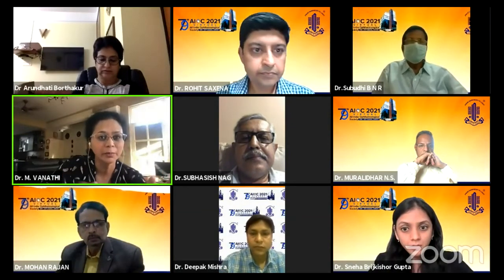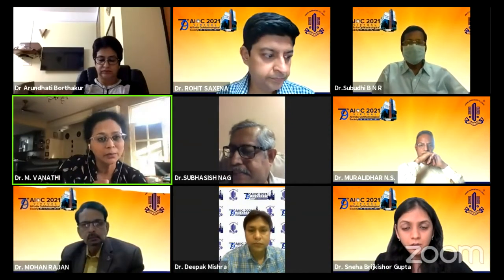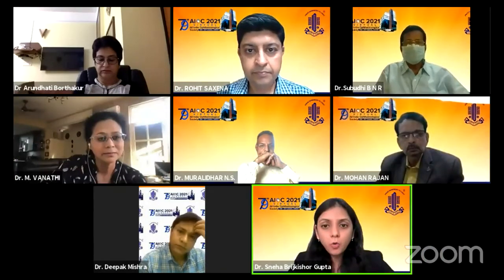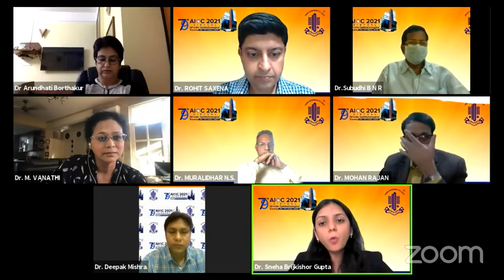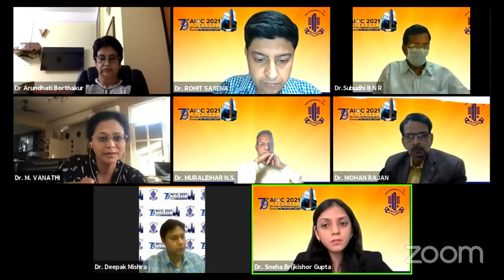One question to you, Sneha. How did you compute this? Of course, I guess it is a software which is inbuilt, but what was the population with which you compared to evolve this simulation? Ma'am, we had incorporated 529 eyes initially, and now we are still including whatever patients we are adding every day. So you have used normative data of refractive surgery patients of Indian eyes, and you have compared their biomechanical changes which have happened, and you apply this to your test population. Is that what I understand? Yes, ma'am.